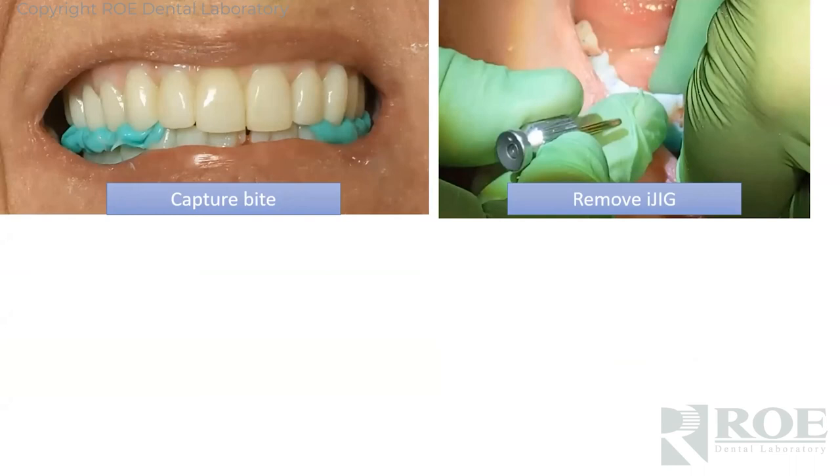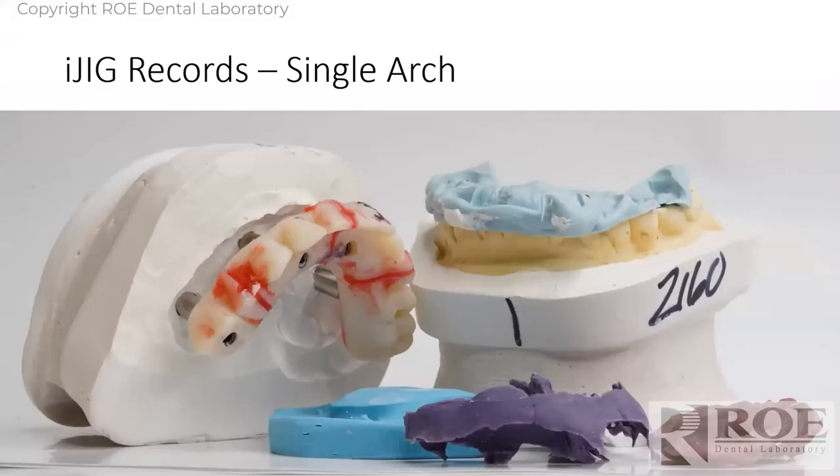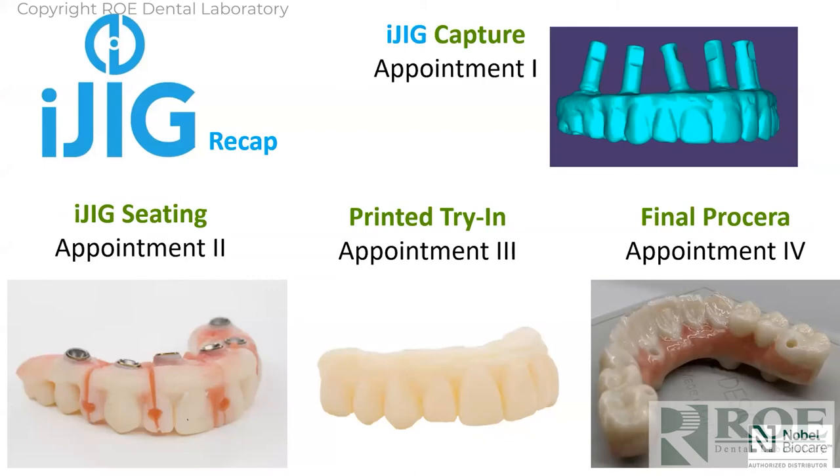If it's dual or light cure, fully equilibrate. Capture a bite because it's equilibrated, remove the iJIG, inspect the intaglio, make sure there was a reline impression and everything is intact, then send it off to us. Here's what we received — tooth position, implant position, bite registration, opposing, and a reline impression. So now we have an adequate soft tissue model. We make a printed try-in and go to final, or go directly to final because the iJIG was really a prototype — totally up to you. That's four appointments: digital impression, iJIG seating, prototype, final. The prototype appointment could be skipped.